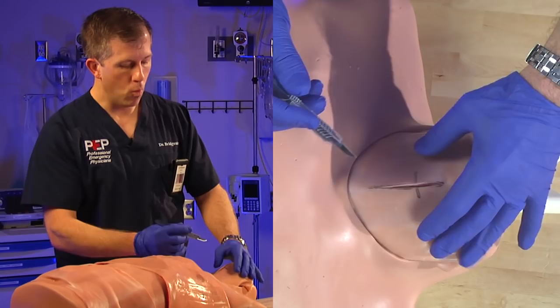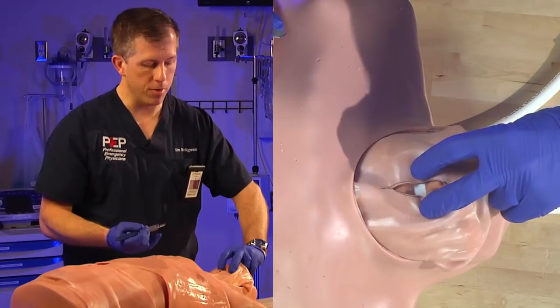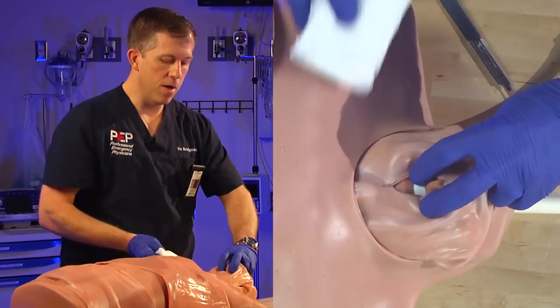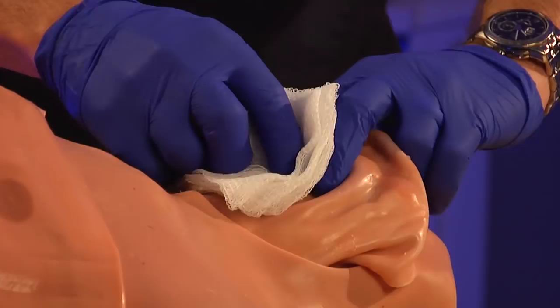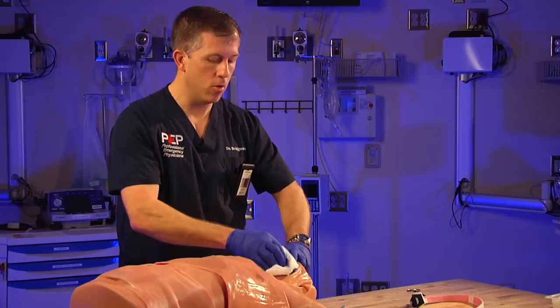Once you've made that incision, make a blunt dissection down to the membrane. In this patient without much adipose tissue, we can very easily see that pearly white membrane. Once you've identified it — and sometimes you can't see it because there may be blood — have gauze readily available to clear the field. Use your finger to bluntly dissect through any adipose tissue, use gauze to remove excess blood, and use suction if you've gotten into a bleeder. Then find that membrane.